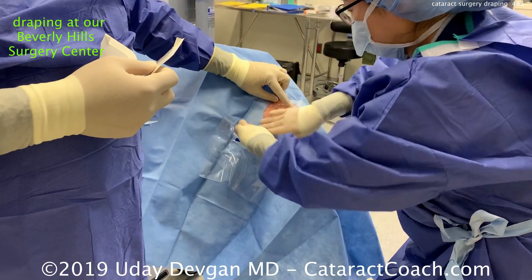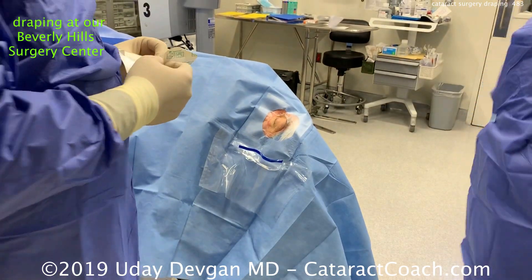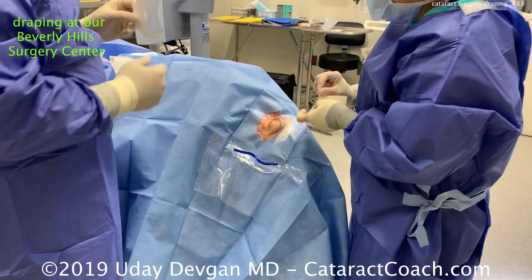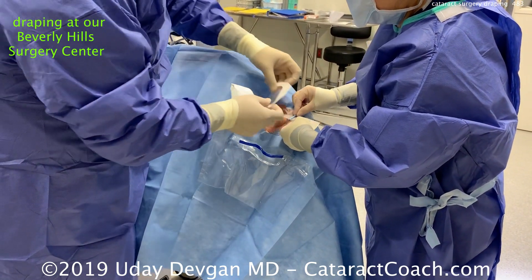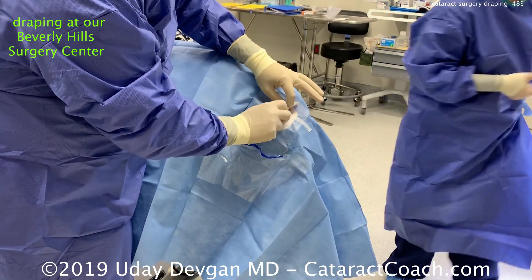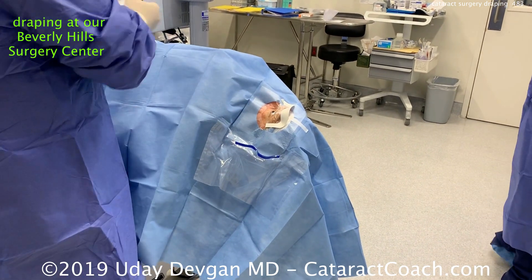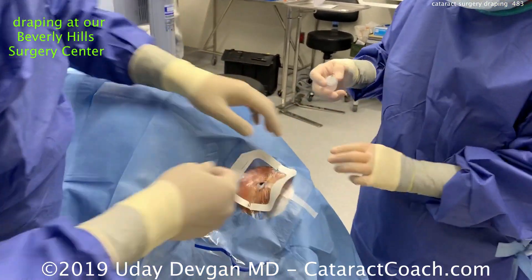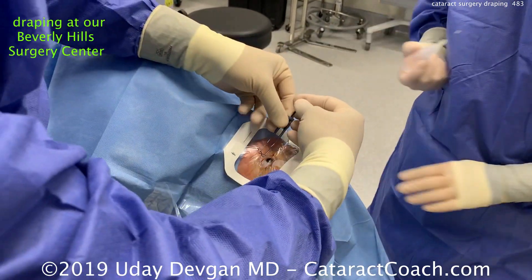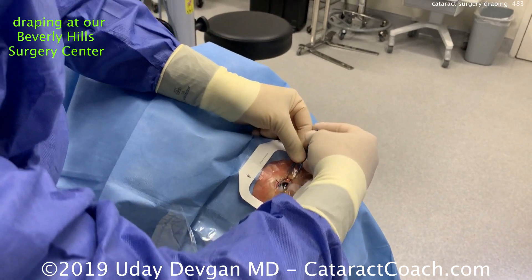In my right hand I have the Tegaderm drape that's been cut in half. My assistant will then use a single SteriStrip to open up that eyelid. There's a Tegaderm being placed on the upper eyelid and another one on the lower eyelid — again never touching the eyelid with my gloved hands. Speculum goes in the eye and we're ready to go.